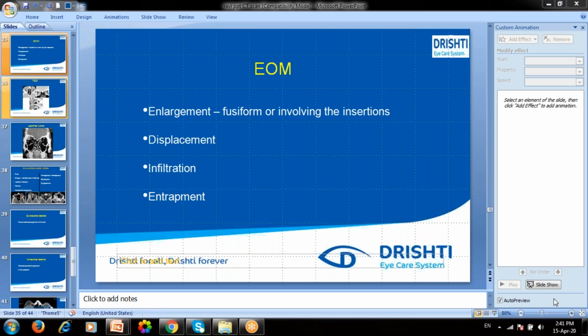In all the advanced CT scans, these things will be different from your old CT scans. There are different types of CT scan machines, but if you write which type of report you want, and the radiologist sends you the same report, it doesn't matter which CT scan machine you use. It totally depends upon which area you want. So your clinical evaluation first has to be done.